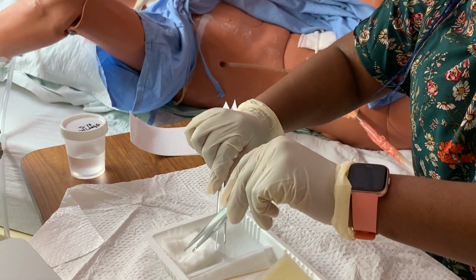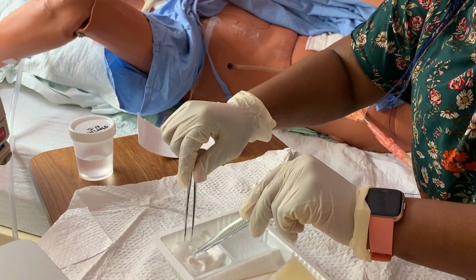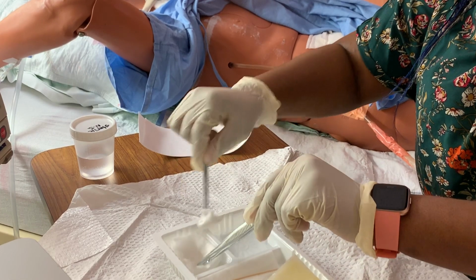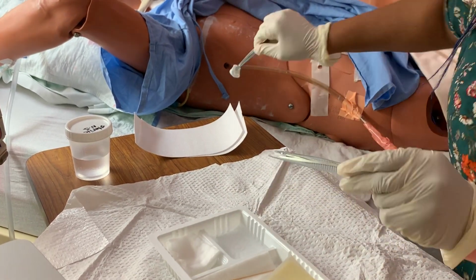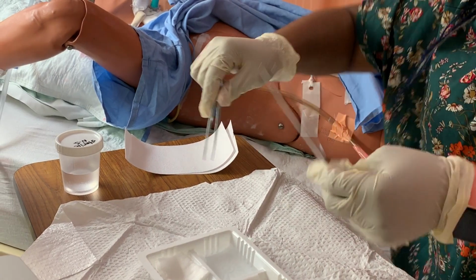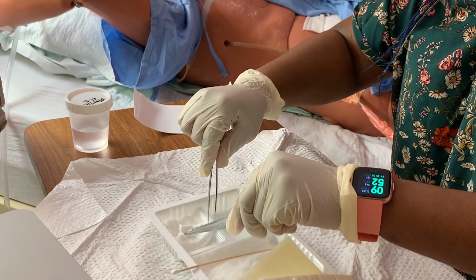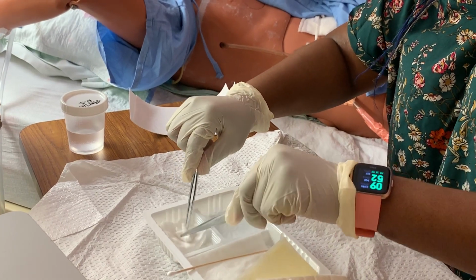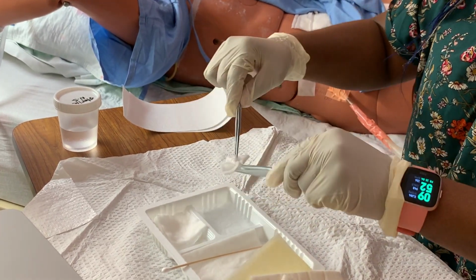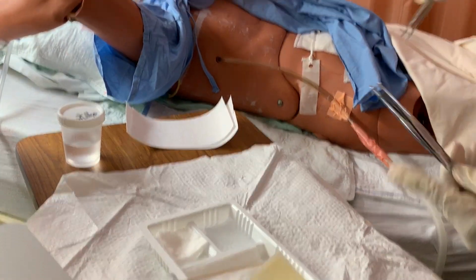Get another one. So I'm gonna clean a bigger circle there. Make it a bigger circle, one swipe down.